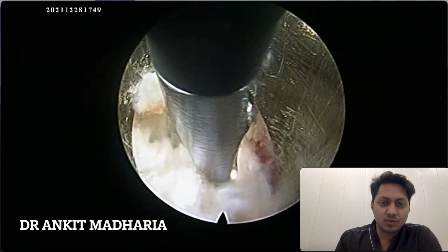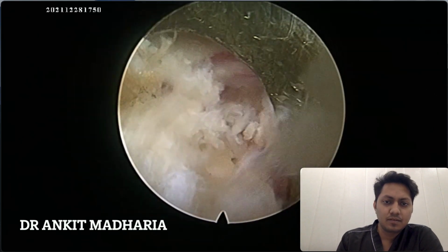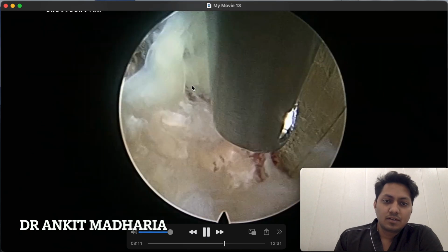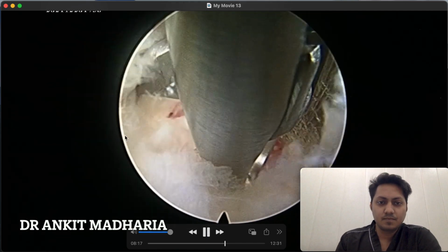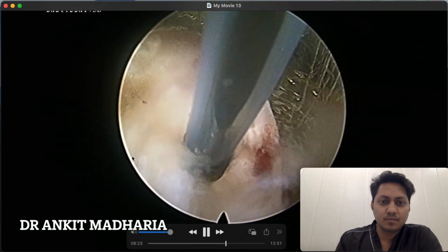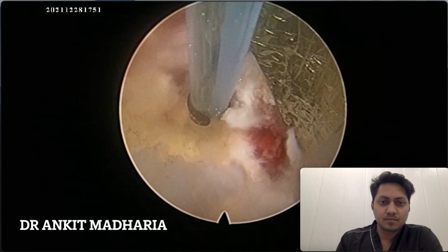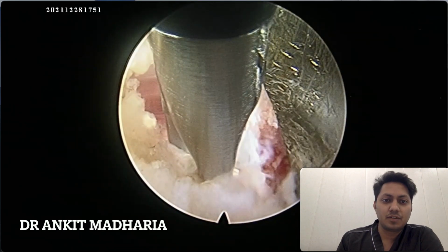This is an annular cutter used to cut those parts of the annulus. You can see our nerve has been very well decompressed in the lower part of the middle zone and the lower zone. Some part of the disc is remaining here, which will be subsequently removed. You must always be careful not to touch the dura when we are using a radio frequency probe.